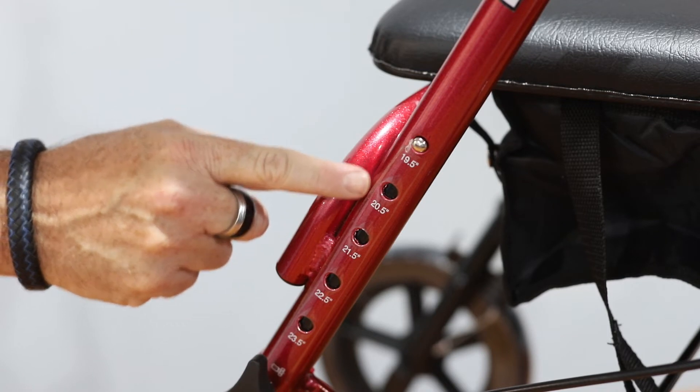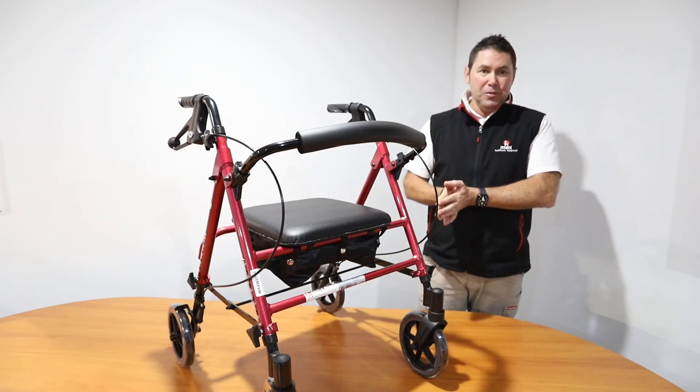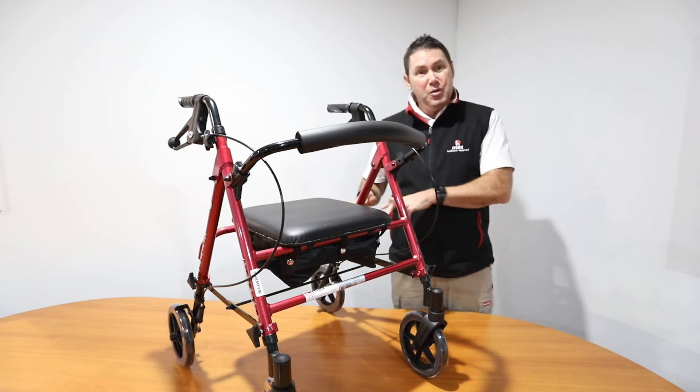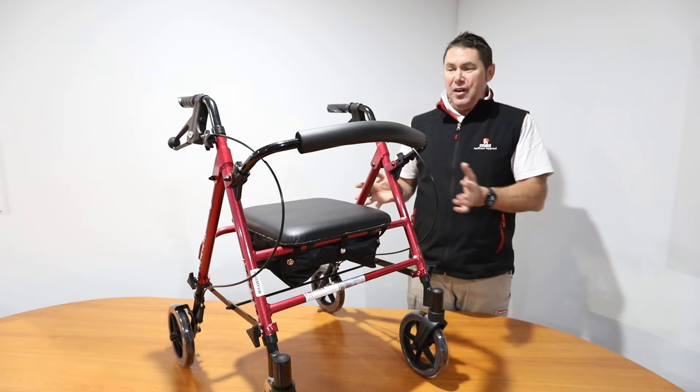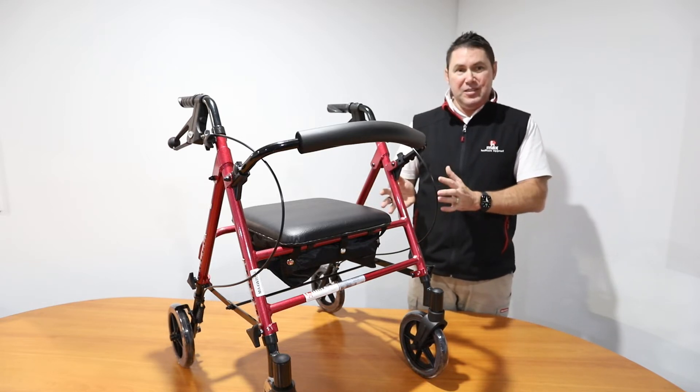The seat height on this can be adjusted from 500mm up to 600mm, and the overall height of the walker adjusts from 785mm to 1000mm. That makes this a really great option for a variety of client heights.